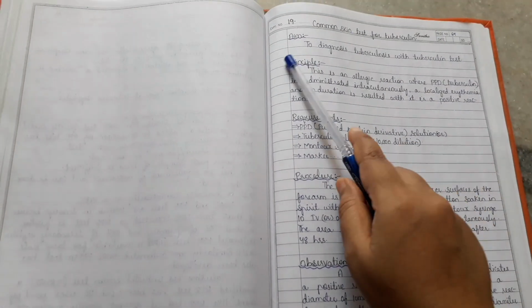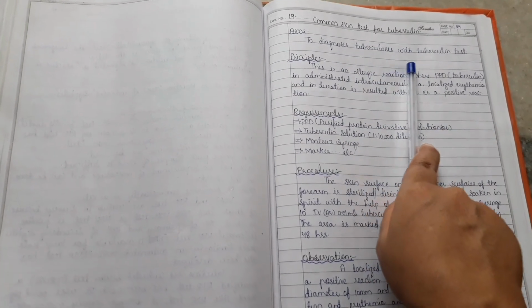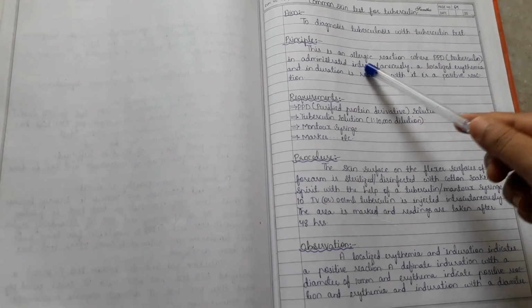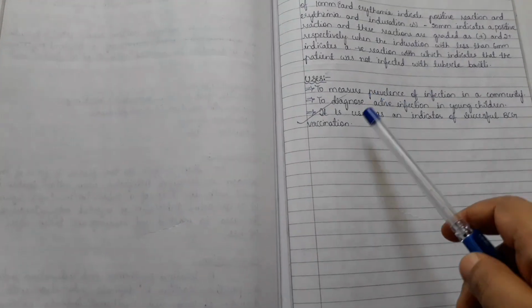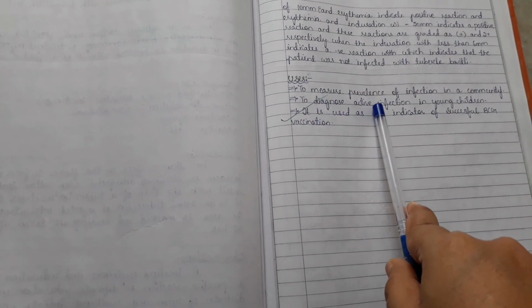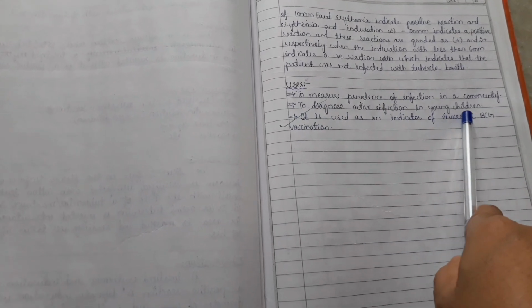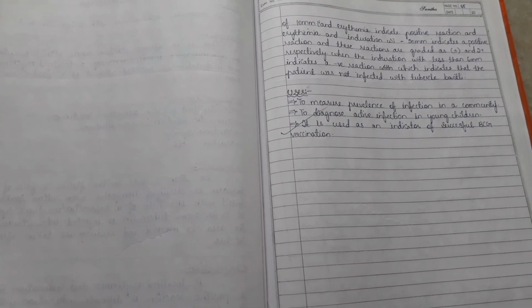The 19th one is the Mantoux skin test for tuberculin, to diagnose tuberculosis. So this is the principle and procedure. It is used to measure prevalence of infection in a community and to diagnose active infection in young children. It is also used as an indicator of successful BCG vaccination.